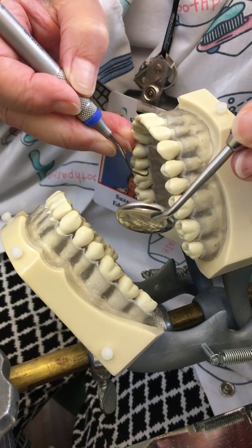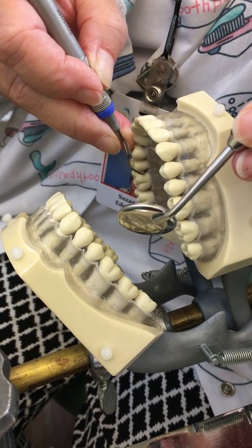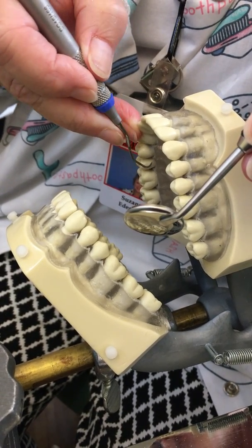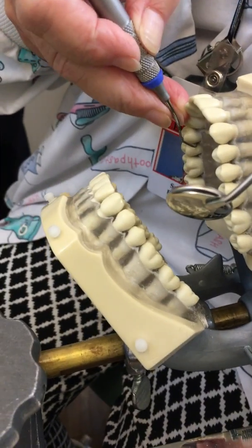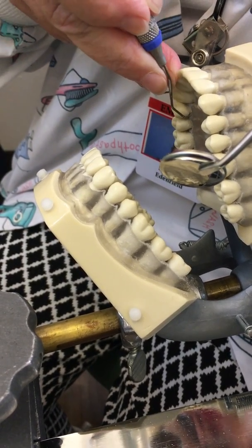I'm going to overlap my strokes. Lateral pressure on the coronal but not the apical. Strokes are continuous. Modified pen grasp — firm grasp, firm fulcrum.